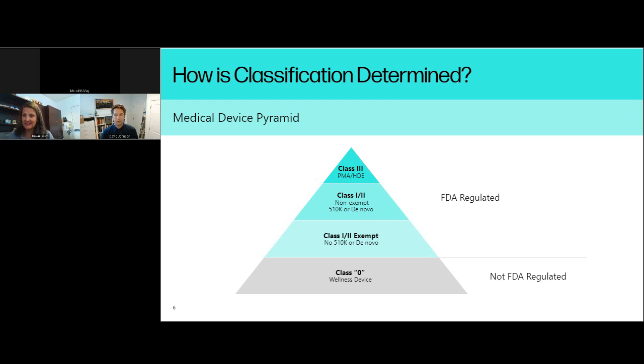So, for instance, a 2077 device will take 4 to 6 weeks of testing. We can test in parallel. You test them in axial compression, shear, and torsion if it's a cervical device. We'll use multiple frames, or we'll do one size at a time, in which case, instead of 4 to 6 weeks, you're going to look at 8 to 12 weeks for testing. So that's the difference in the requirement.